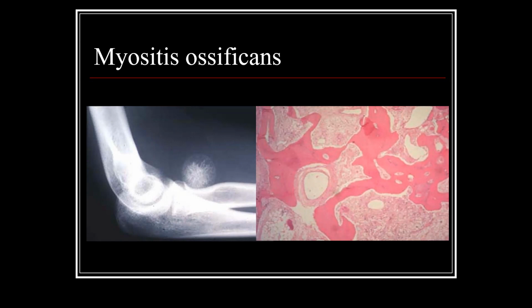And I don't know the answer to that question, unless we're just seeing the proximal and deeper outer portions more easily through this central portion, and you can see that there's still sort of this sharp margin here. So the bone again tends to be woven type of bone that is fairly benign and bland appearing, with a slightly cellular spindle-shaped stroma producing it.